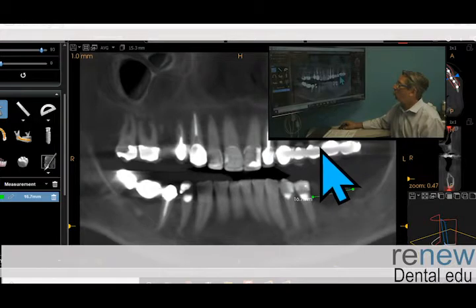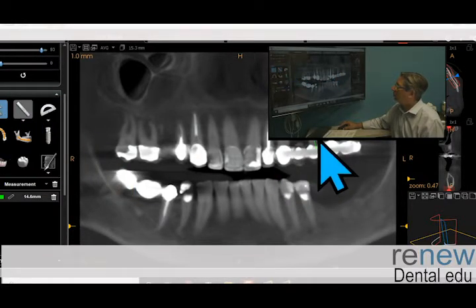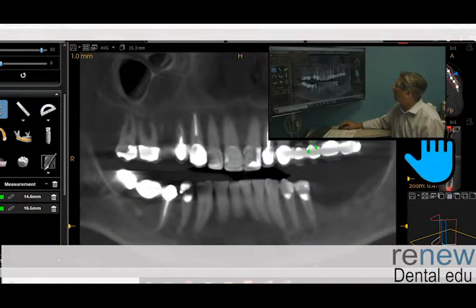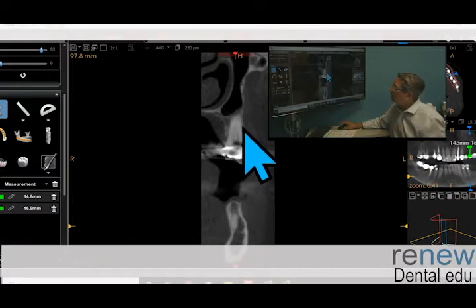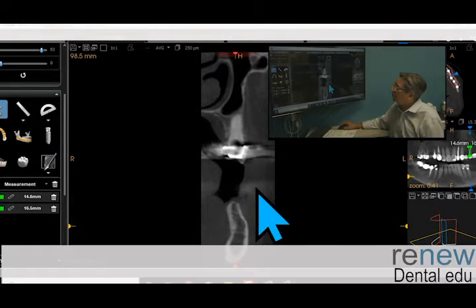So then what do you do with the upper? Since this then gets cut out, we're now looking at the extraction here, right? So this is going to go away. And let's look at that tooth here a little closer on the CT and the slice view. And here's what we have. Here's the problem. Our facial plate is very thin, and we have also a sinus involvement right towards the tip of the apex of the root. So you're going to want to graft this site for sure and try to preserve the bone.